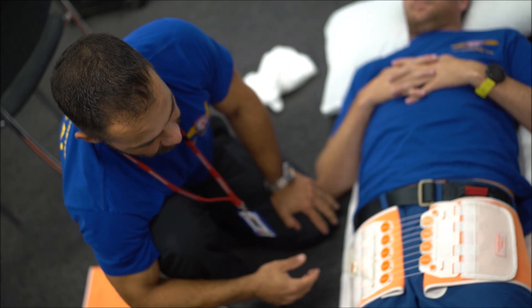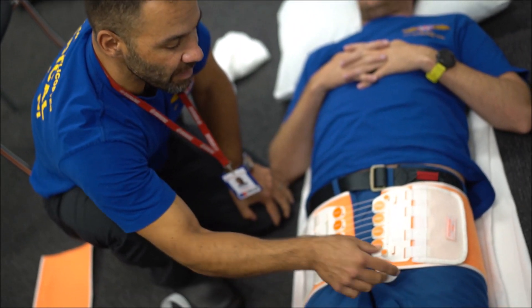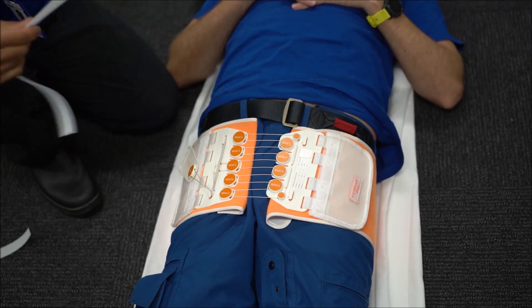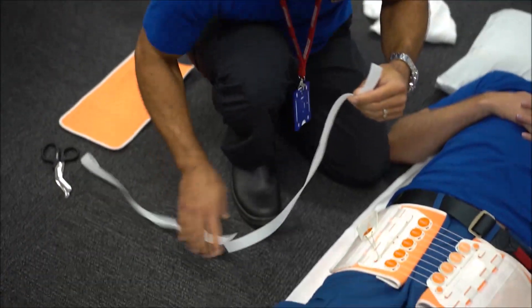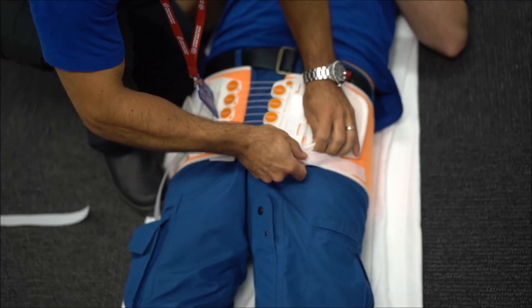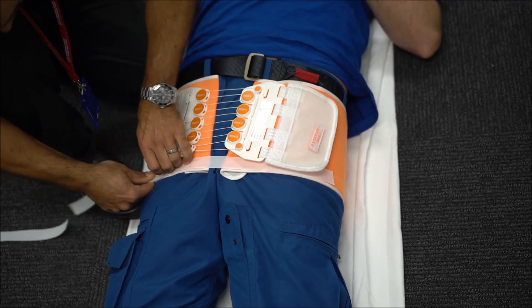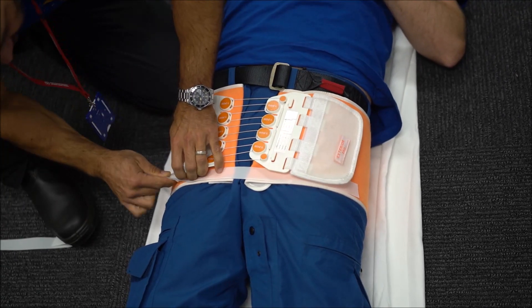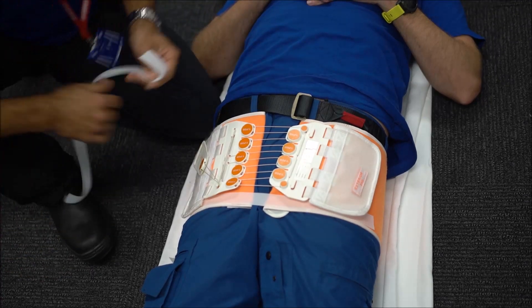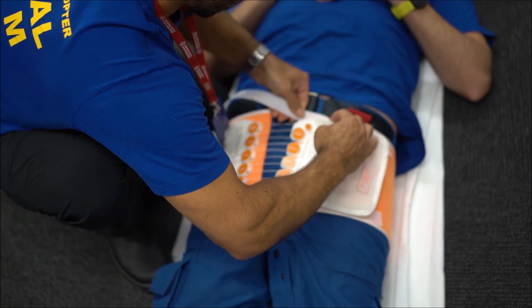One way of managing this would be to cut a hole, which is in the Velcro here, but that's impossible in this particular one because of this corset arrangement. So one solution is to get strips of the hook Velcro — and ideally it's a two-person technique — but one strip is carefully laid along the bottom edge of the material with a little bit of tension applied as you stick it down, like so, and then the second strip is laid carefully along the top edge, similarly with a little bit of tension.